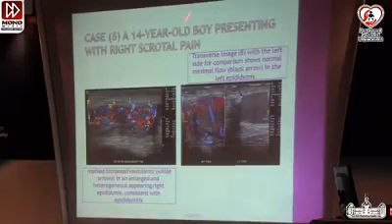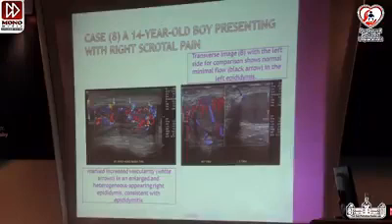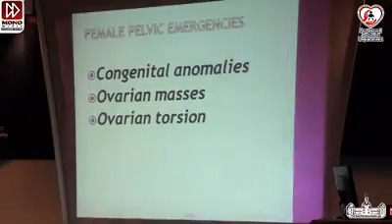This case here, a 14-year-old boy presented with right scrotal pain, hypervascularity of the epididymis. Compare the right to the left side. You can see normal vascularity. Here is hypervascularity, and this fluid signal here surrounding the epididymis, a case of acute epididymitis.